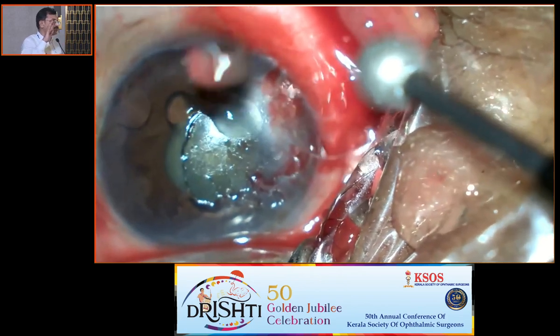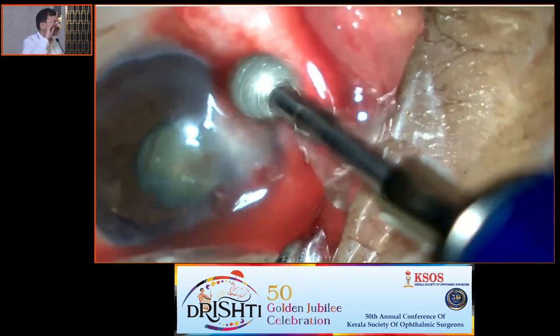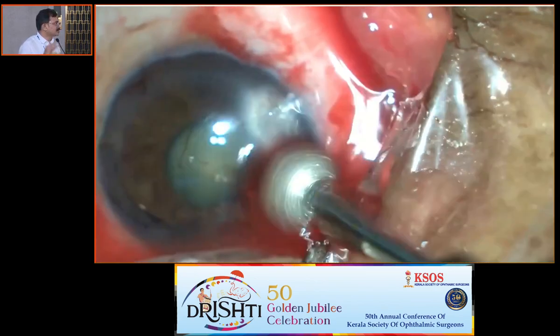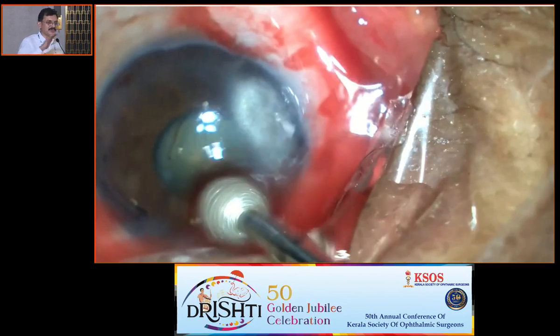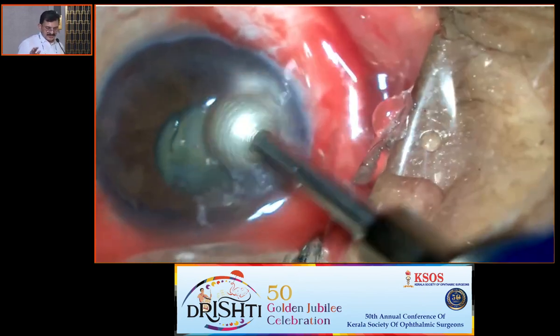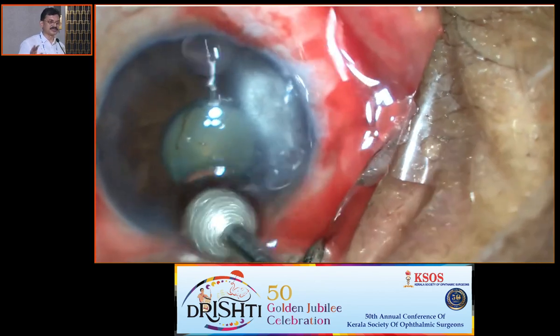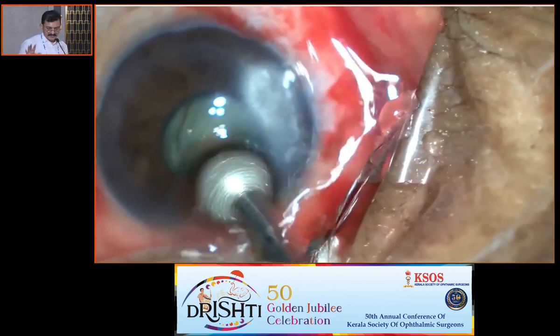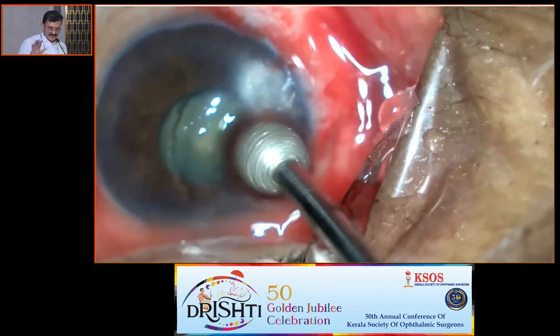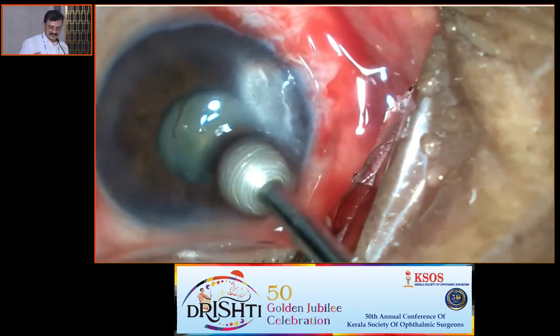The anterior surface quality of the cornea is what is important for vision. It's not the clean-looking cornea like glass. So you just peel off the pterygium, and whatever tissue is left, you can nicely use the diamond bar even in the pupil area and make it very smooth. You get a very nice post-operative vision after cataract surgery. Wait for 6 weeks. Even with the pterygium onto the pupil covering the entire thing, you get excellent results if used.